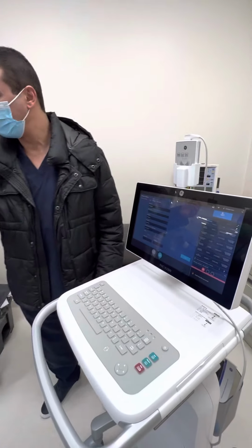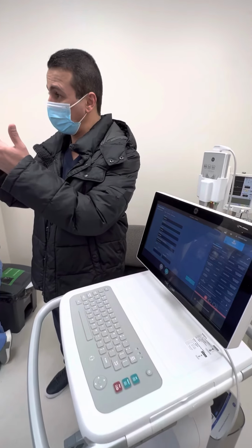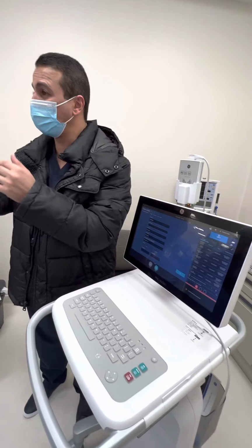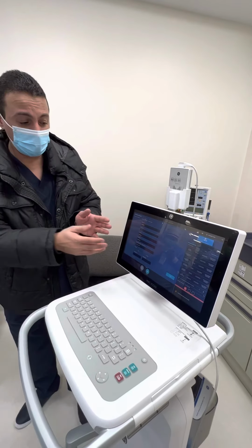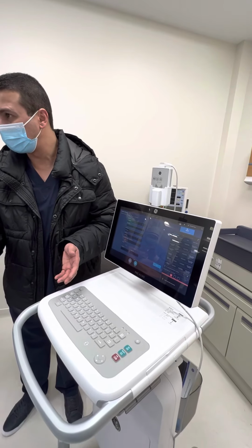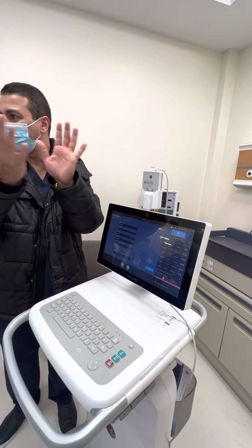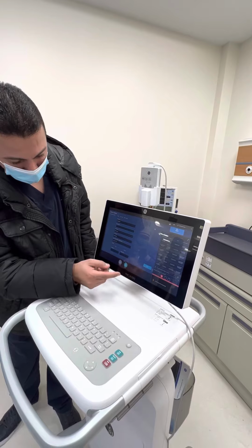So as we highlighted, a report or an order with 2 reports or 3 reports will be stuck in Muse. 1 order, 1 report, it will show up in the patient's profile. 1 report without an order will be stuck in Muse as well. Okay? So even if you do it manually, you put the patient IDs manually, there's still no order. So please make sure that 1 order with your report is going to be attached to each other before you do the transmit. So how to do the transmit? So reject.